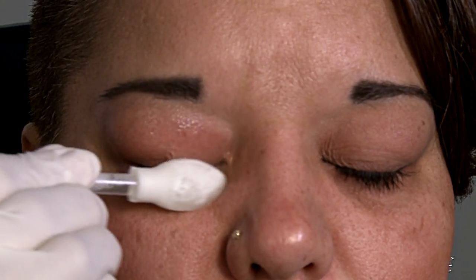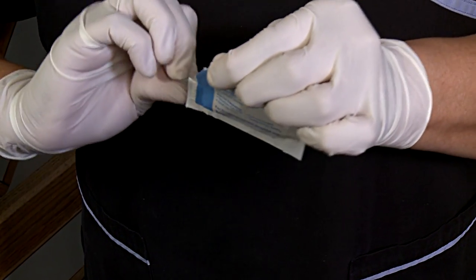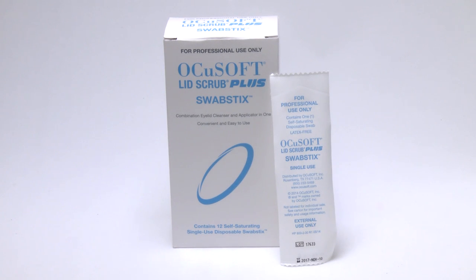Remove OkiSoft Lid Scrub Plus swab stick solution by rinsing the eye area with eye wash or saline wipes. A follow-up appointment should be scheduled for a second treatment. Only one swab stick is needed per patient and they are available in a box of 12. Dispose of after each use.